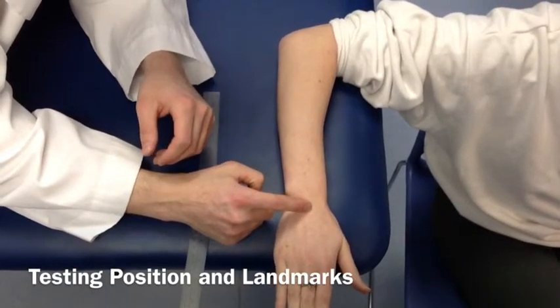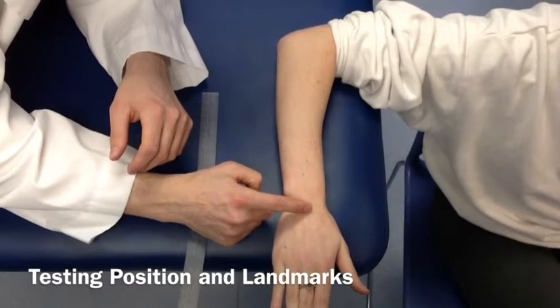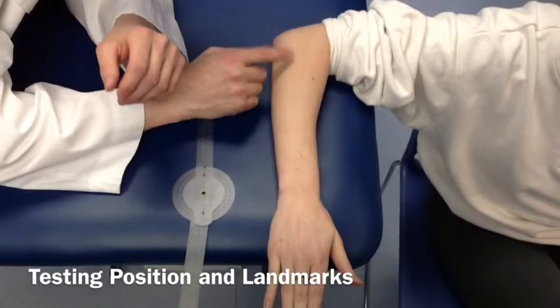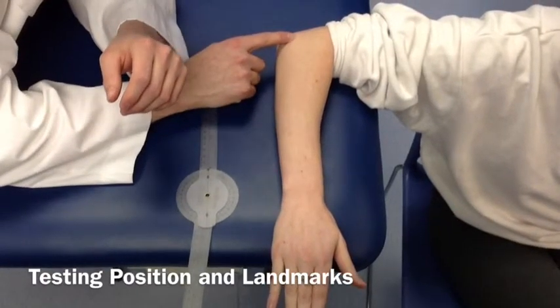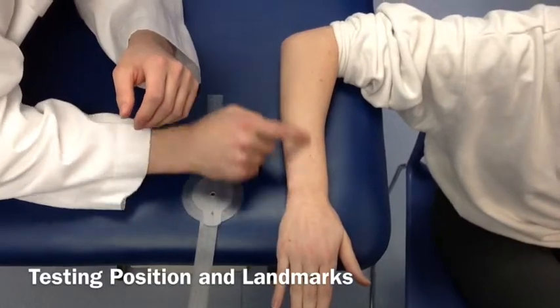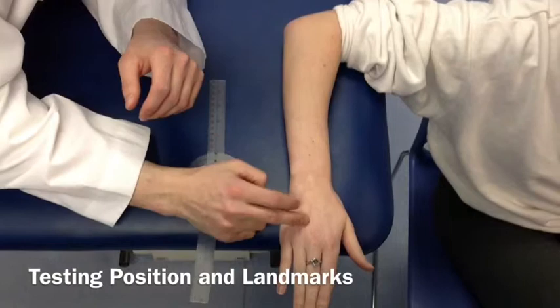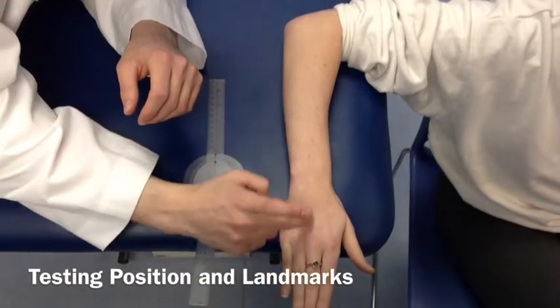We're going to have our stationary arm coming from the capitate, moving down along the arm. If they're in this position, you can use the lateral epicondyle, but for all intents and purposes, we're going to have it along the posterior part of the arm, midline. The movement arm is going to be along the third metacarpal.